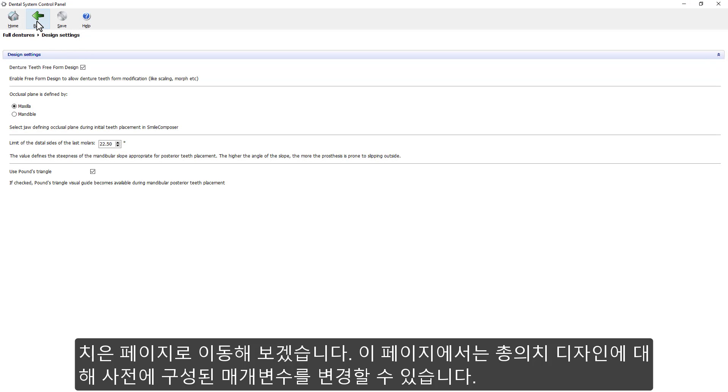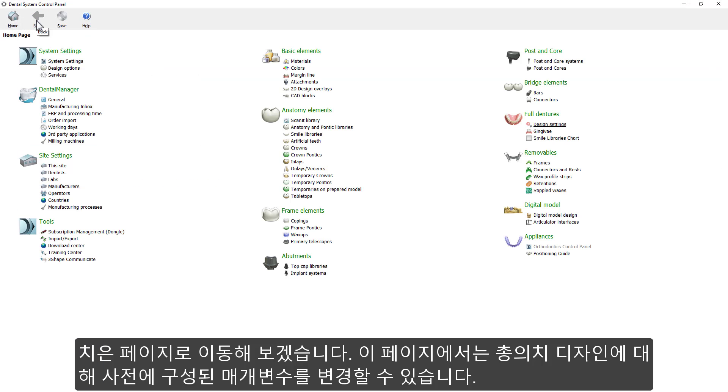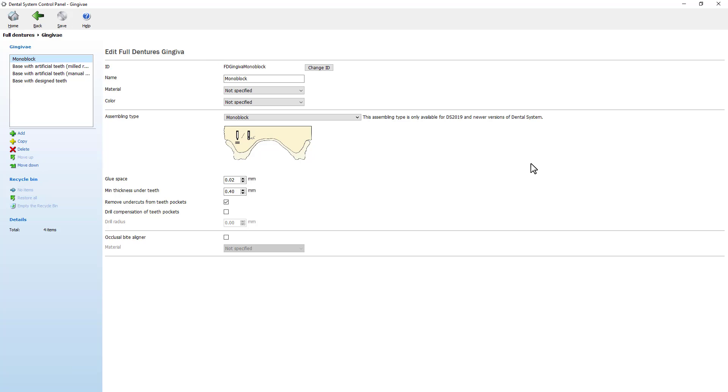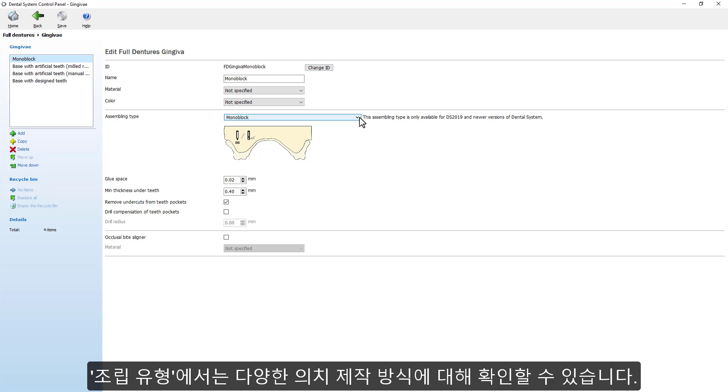Now, going to the Gingiva page, we can change the pre-configured parameters for full dental design, such as Assembling Type, which provides a list of different assembling methods.